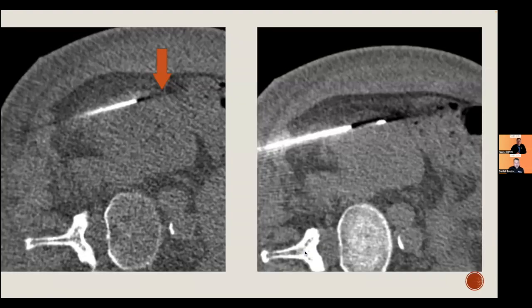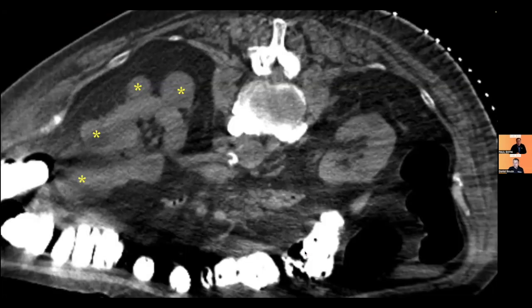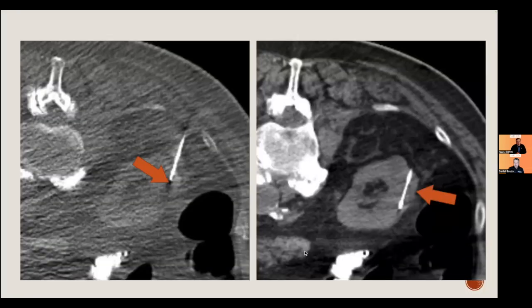So we proceeded to perform the biopsy in that location, and you can see how the tray is within a few millimeters of the capsule and entirely within the kidney. And this was diagnostic with only 2 core specimens. Here's another example. Notice that one of the kidneys has many cysts, which makes it a little bit tricky to do the biopsy. On the other side, we have fewer cysts, and there's a nice area of thick cortex, and we can choose a somewhat tangential approach, and that's what we attempted.